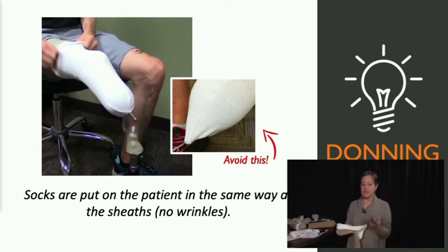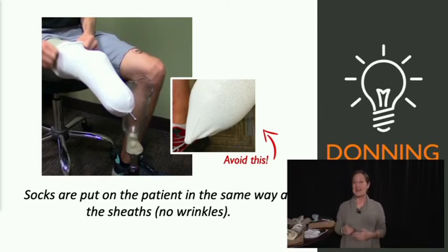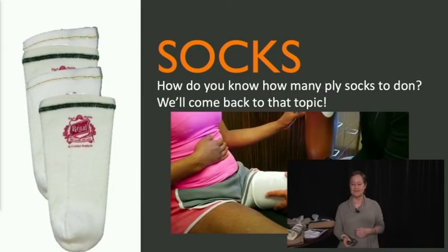If you look at the picture, you'll see a sock hung up on a pin. So that's also a no-no. People need to reach down and feel and make sure that the sock is in the right place. So how do you know how many ply socks to don? I mentioned this already. We're going to come back to that topic for those of you who aren't sure how to instruct your patients in that.